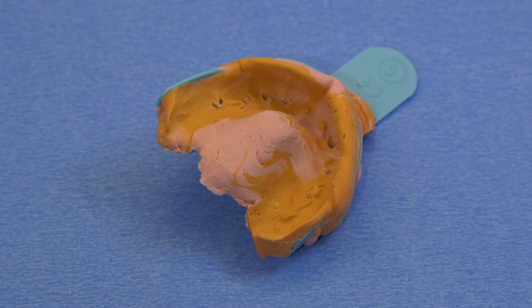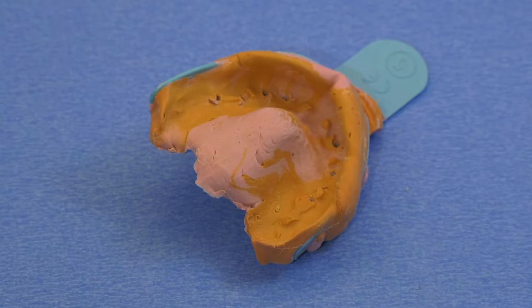The next step you're going to do is have your surgical guide stent made, right? And let us help plan the case, and you'll place all the implants. And I know you all know how to do that at this point. Once you've placed all those implants, take your final impression of those implants in place. And if you can do your bite right there, do it that day.